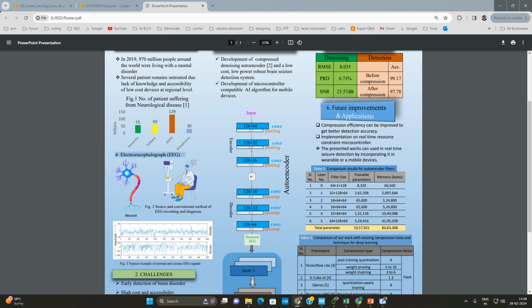It will create problems when we deploy this model on a microcontroller or edge-based device in a wearable. It should be not only lightweight, but also consume very little memory on the device. So we have applied a compression technology, which takes these models and compresses them, making the model compatible with the low power, low cost devices that get fitted in wearable applications.